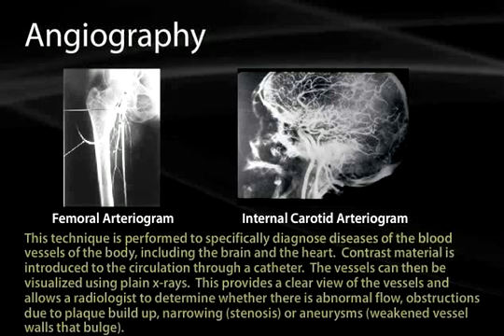Digital subtraction will take a picture of the regular architecture of the bone prior to contrast media, take another one after the introduction of a media, and then subtract the two so that it reduces the bony architecture around the area. This can be both good and bad. It lets you see the detail of the vessels much clearer, but it also has a more difficult time for orientation.